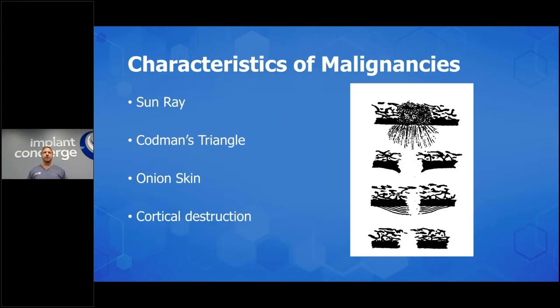And then on the other side, from benign neoplasms or tumors, going to something that's a malignancy. Now, with malignancy, you're going to have that stereotypical onion skin. That's a periosteal reaction. So the body is trying to protect itself and growing bone to contain a structure. But malignancy, what it does, it just destroys everything. And that's always going to be the main finding with a malignancy. There's just destruction.